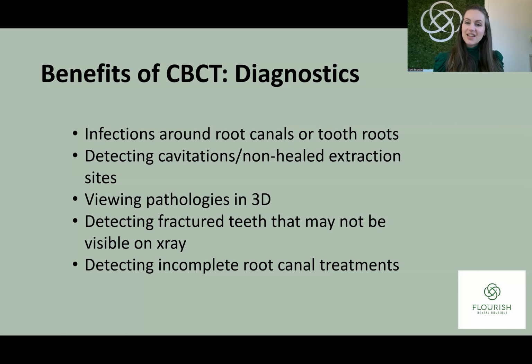The pathologies, like we talked about sooner, not only are we able to see any cysts or tumors or growths in the jawbone, but now we can see these in 3D. So we know if it's something that's aggressive and taking away existing bone structure, or if it's expanding what should be normal bone structure around it.